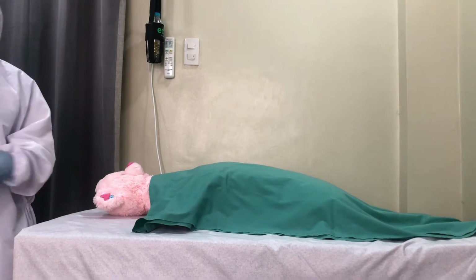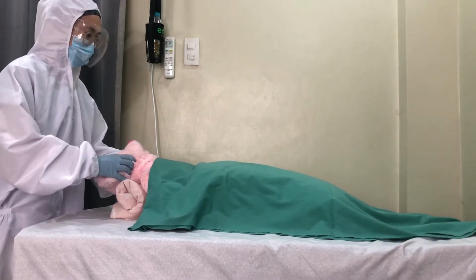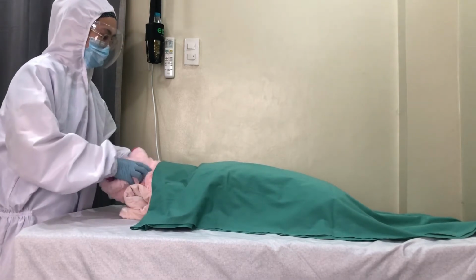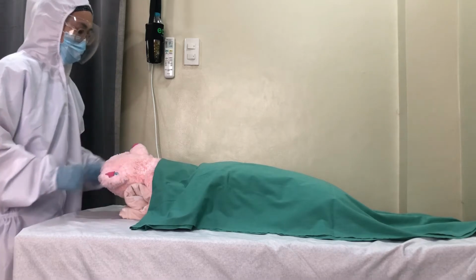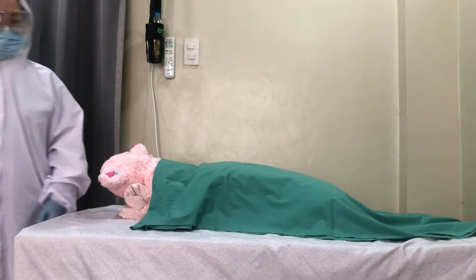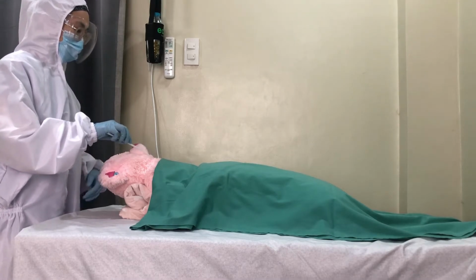Position the patient in a sniffing position. Since the patient is COVID-19 positive, an intubation box should be used for protection against infection. Since a video laryngoscope is available at the ICU, it should be wrapped with a disposable cover and will be used to optimally view the upper airway of the patient.